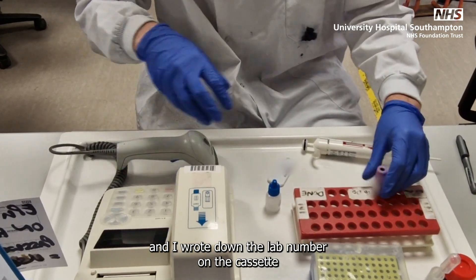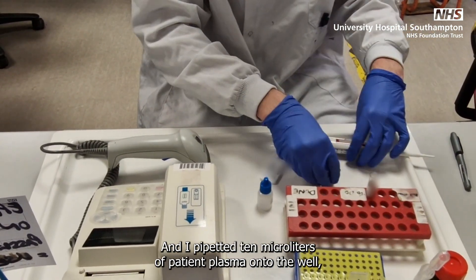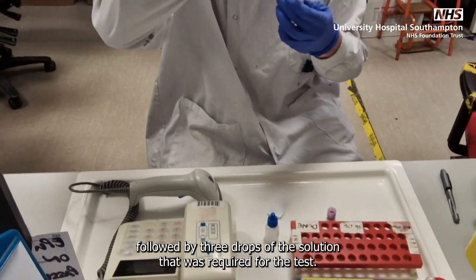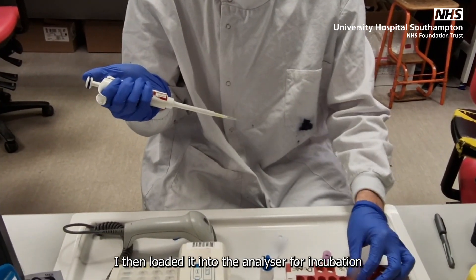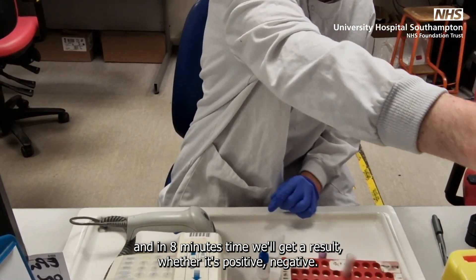I wrote down the lab number on the cassette, and I pipetted 10 microliters of patient plasma onto the well, followed by three drops of the solution required for the test. I then loaded it into the analyzer for incubation, and in eight minutes time we'll get a result, whether it's positive or negative.